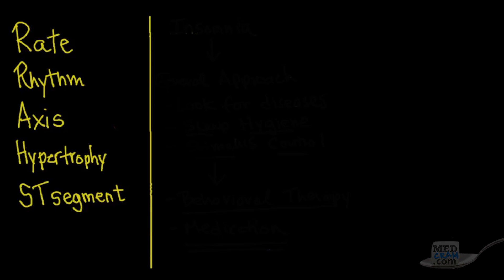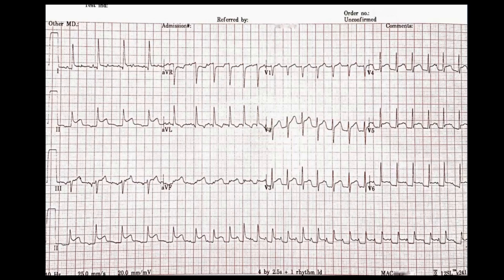Let's first look at the rate on this EKG. At the bottom we can see the criteria for what is set. The speed of the EKG is 25 millimeters per second, which is pretty standard. What's not standard is the 20 millimeters per millivolt — you can see that the standardization box is about twice as high as it would normally be. Keep that in mind.